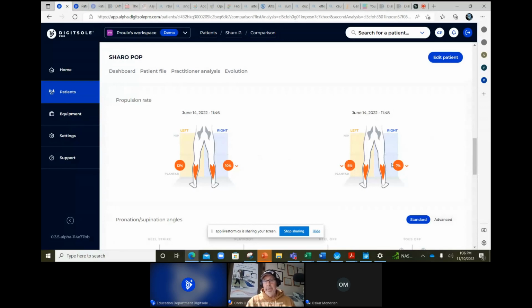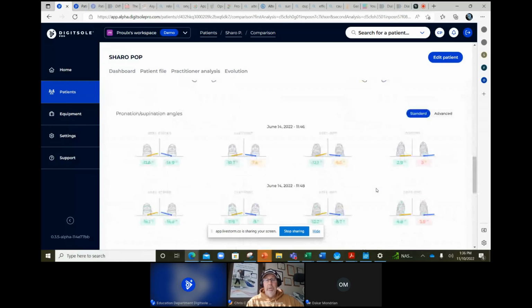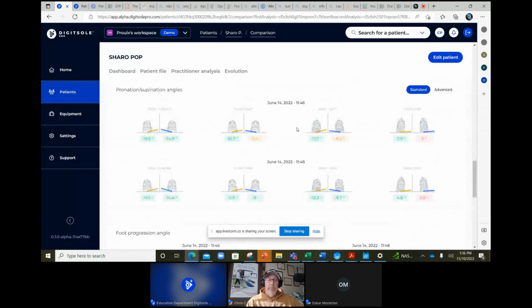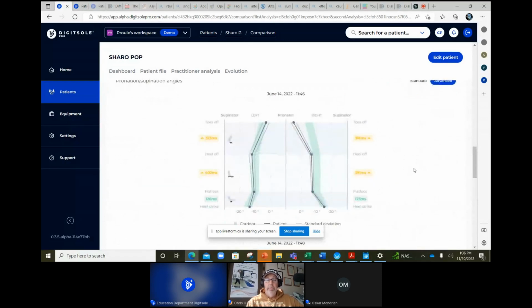So we're still at 8 and 7% of unusual loading in the plantar flexors, and it actually increased again as we started getting her to walk faster, and we actually were able to elicit some discomfort in her lower back as well. Now let's look at the foot trajectory, the pronosupination angles, and let's put the graphs up, right? So this is the one that I just showed you.